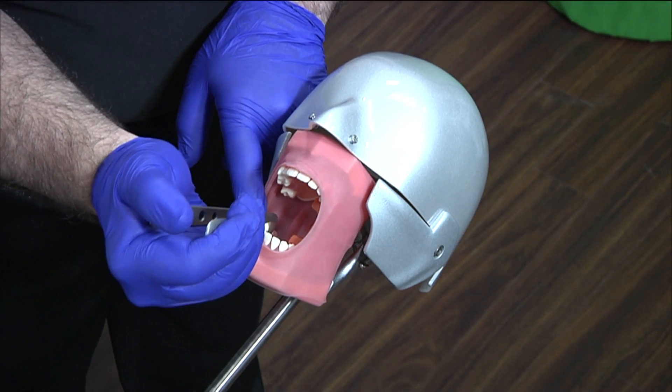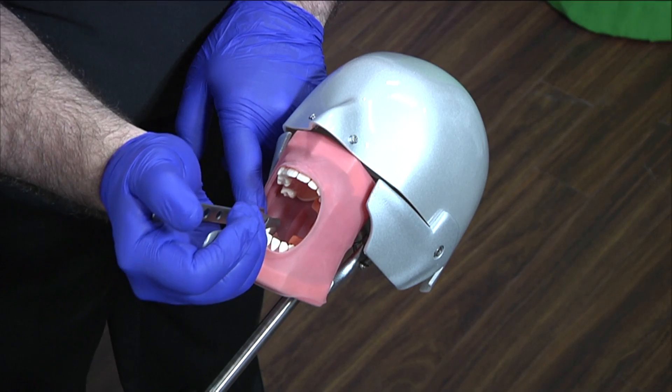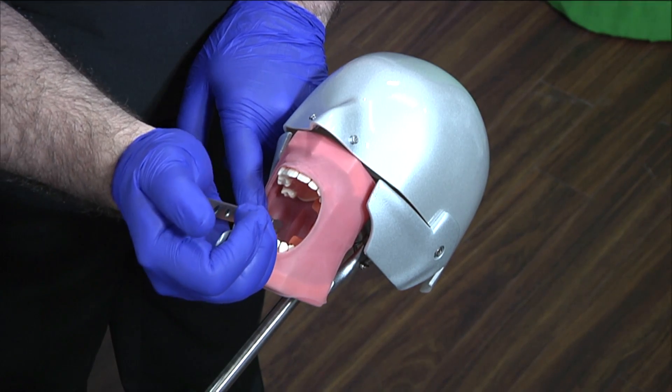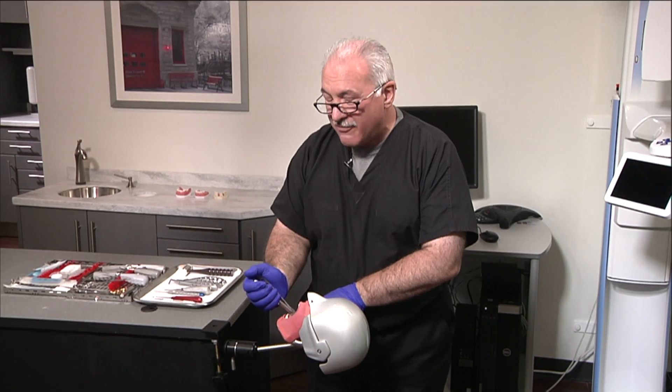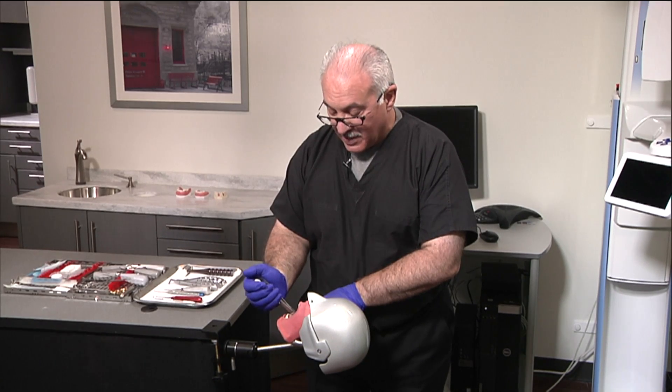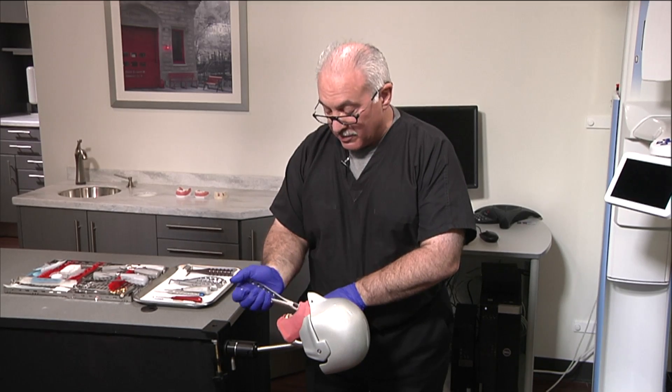Instead of pulling, look at my fingers and my wrist — I'm literally using my hands and the feel of my fingers to bring this tooth to the buccal. More often than not, unless it's really tipped, it's going to release to the buccal. And there you have it.